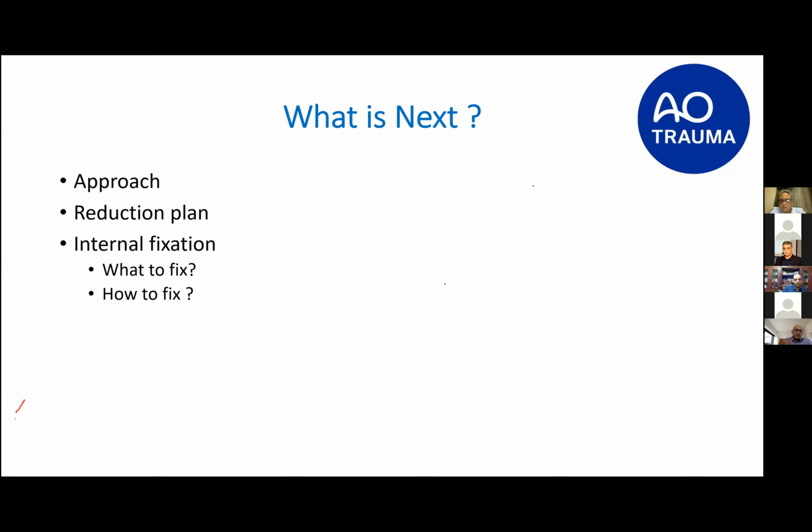But if you're doing arthroscopy in a fracture case, you are more apt to have certain criteria. First of all, you do not exsanguinate the limb. You just do a compression bandage with elastoplast or a very high compression. You do the incision of the arthroscopy through the compression band. You do not use a pump, except gravity inflow, and preferably even without gravity. So it's just the washing out, and you look almost as if it is dry, definitely no pump.